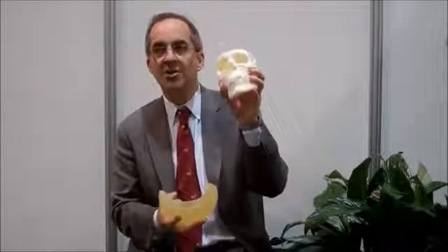All patients undergo bony models because we need this for surgical planning, and the science of what happens to the soft tissues is really for the first time opened up by having 3D printed models, so we can hold in our hands and feel the texture and the contour and understand where the soft tissues are.